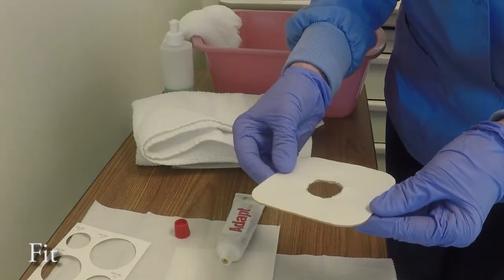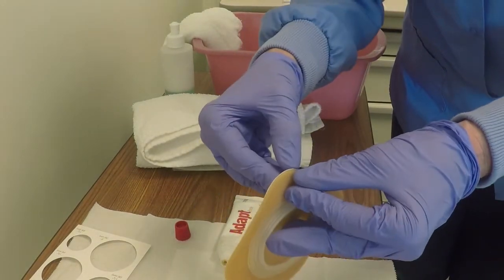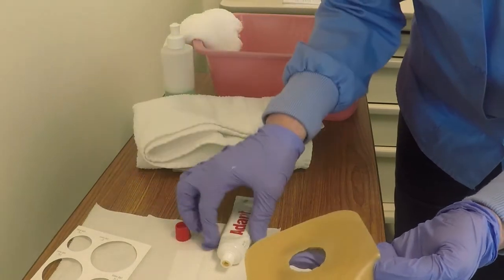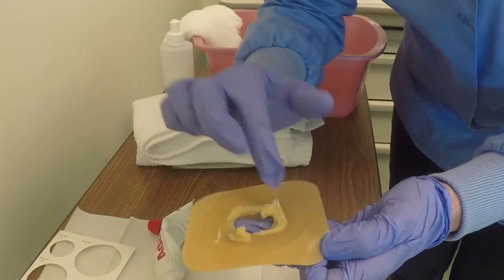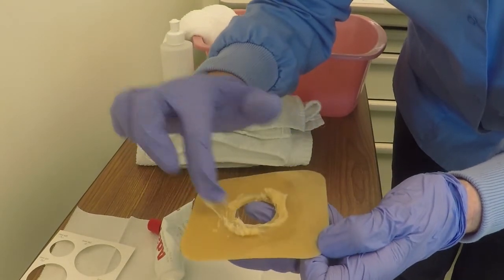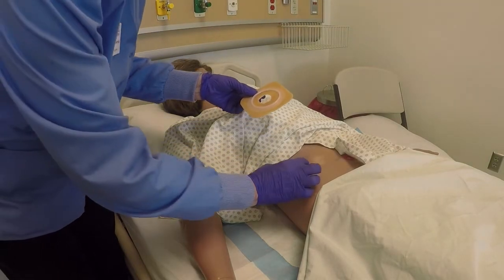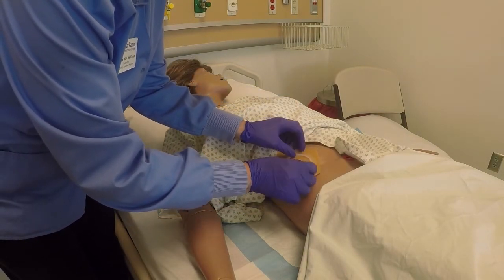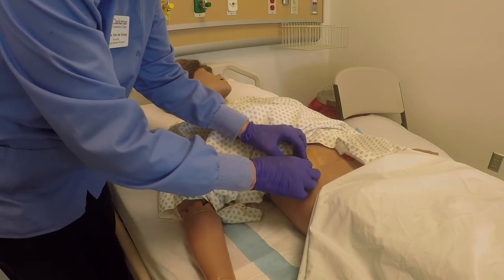F is for fit. Now I'm going to fit the skin barrier around the stoma. First, I'm going to peel back the paper backing — the sticky part of the skin barrier. Then I'm going to apply a thin film of paste around the opening and let that dry according to the instructions on the stoma paste. Now I'm going to fit the skin barrier over the stoma, pulling the skin around the stoma taut so there are no wrinkles. I'll place the skin barrier opening over the stoma and center it.